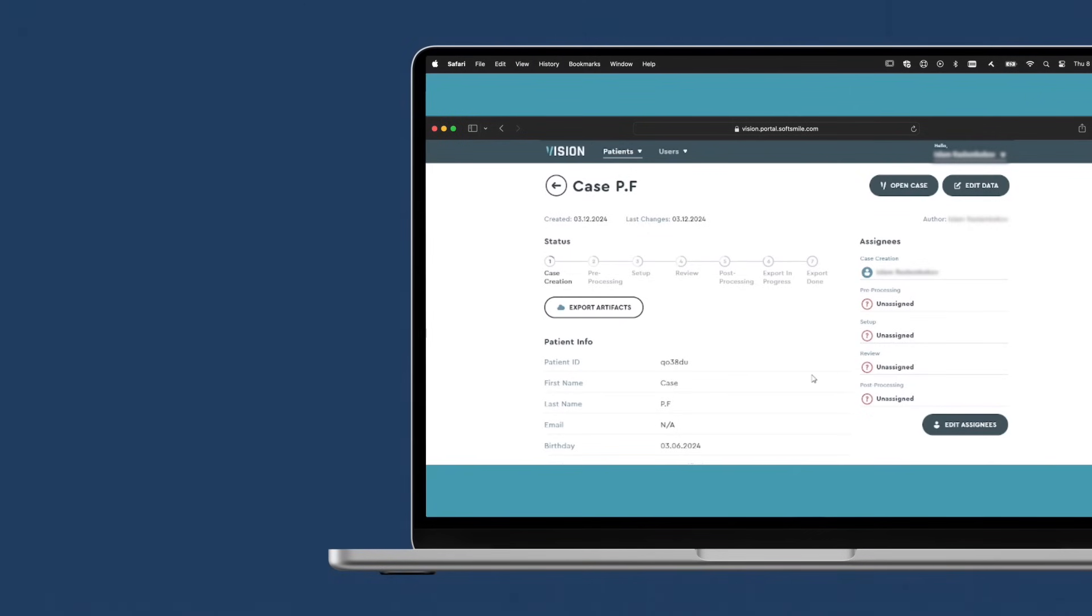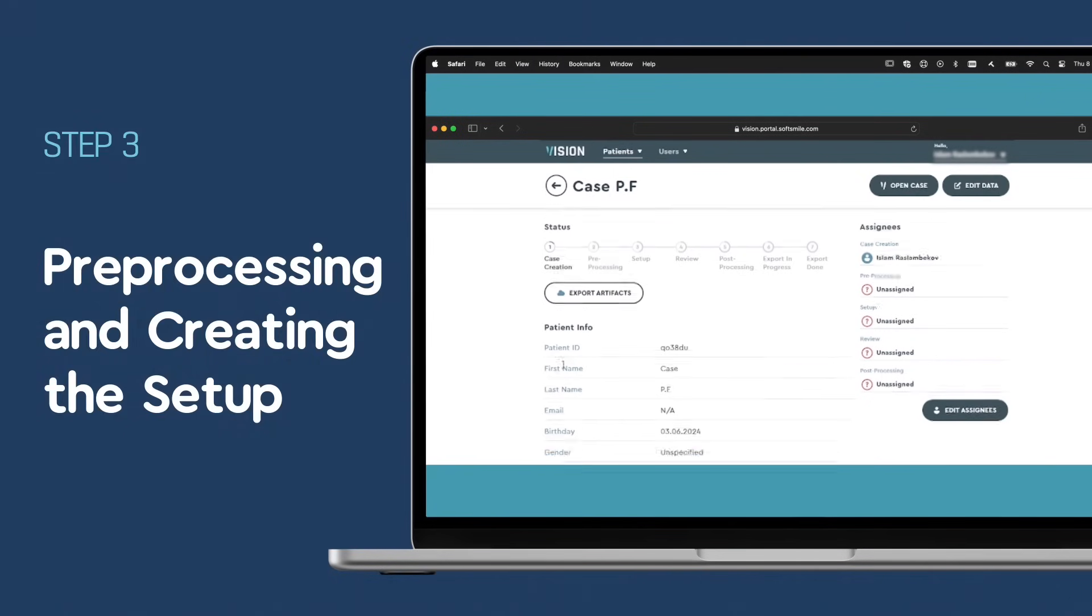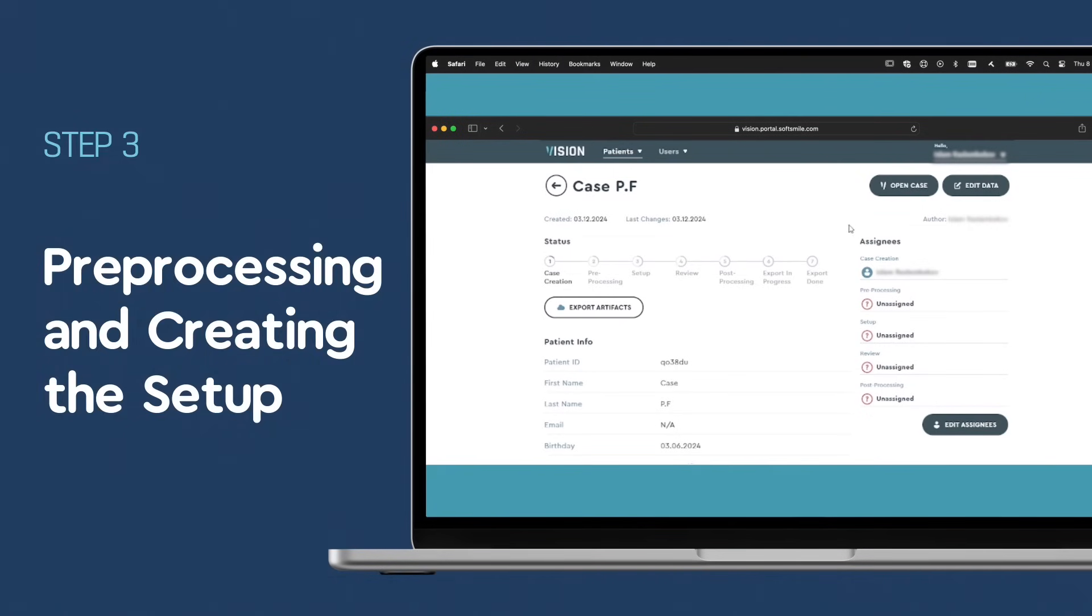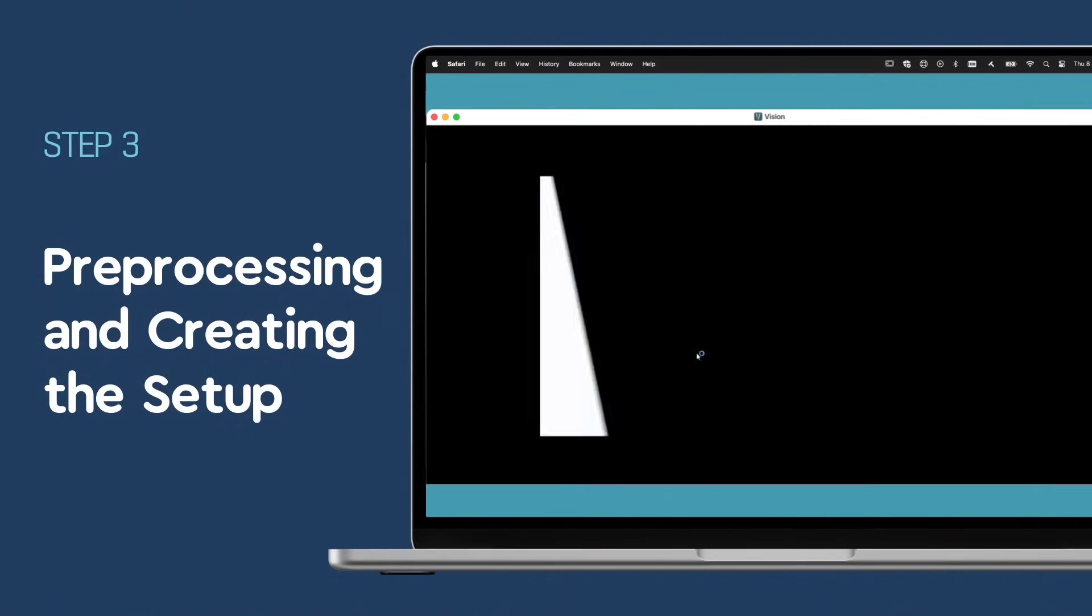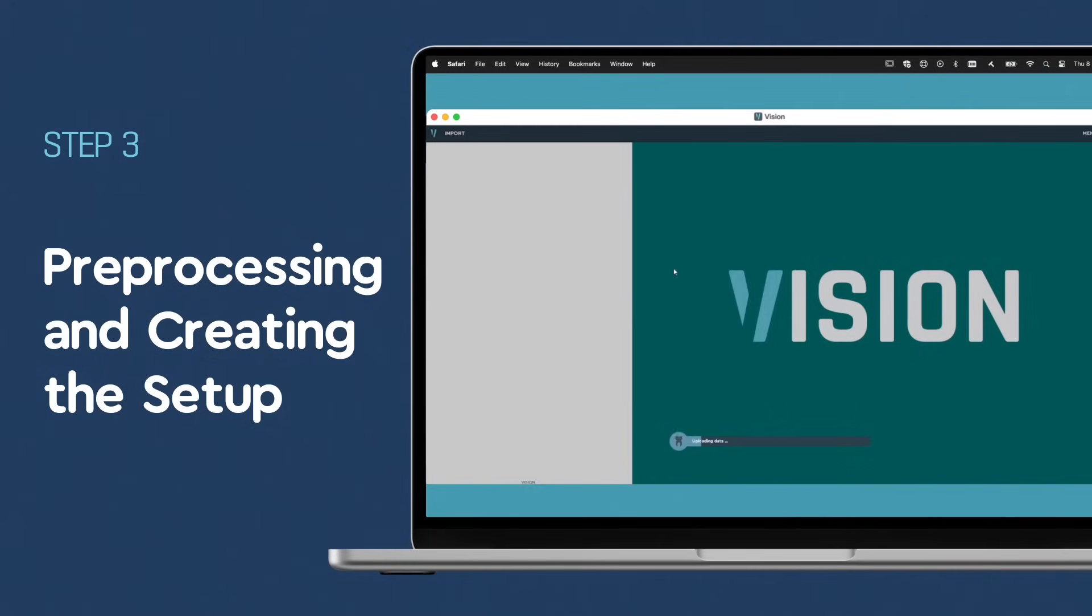Upon receiving your case, our team begins the pre-processing phase, ensuring high accuracy and quality for the final treatment plan through critical sub-stages.